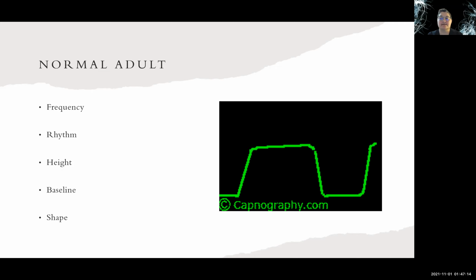It's going to remain at a steady rhythm with the normal breathing rate. Phase 3 should go no higher than the normal end-tidal CO2 reading value. So if you are getting a 37, then the phase 3 plateau should go no further than that 37.